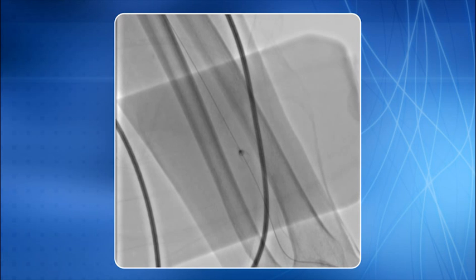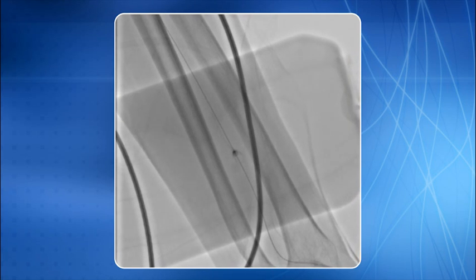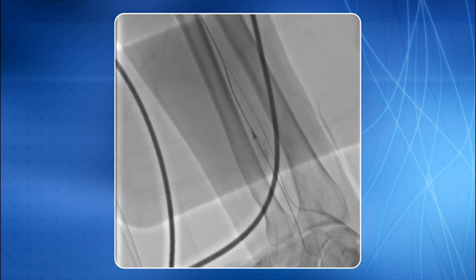We did not remove the introducer sheath and PTCA guide wire. Keeping PTCA guide wire as a road map, we did a high puncture in the radial artery and deployed another sheath over there. The procedure was then completed in usual fashion.